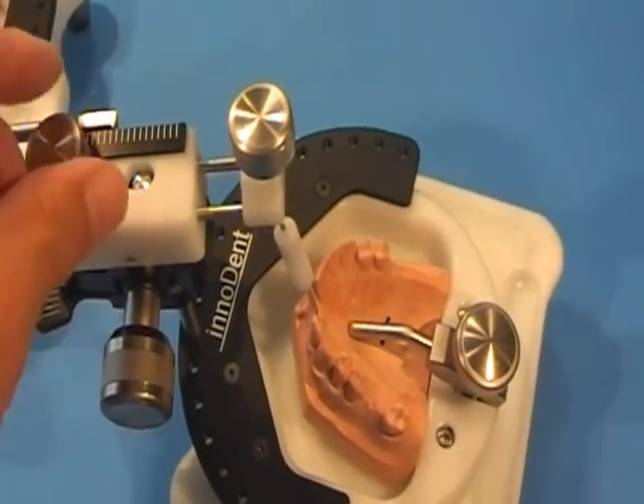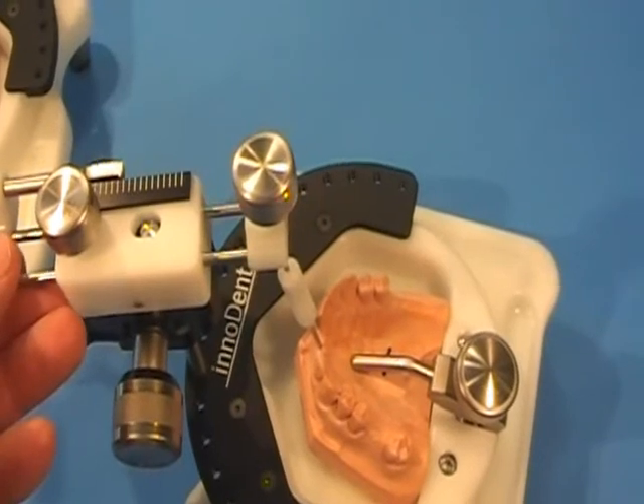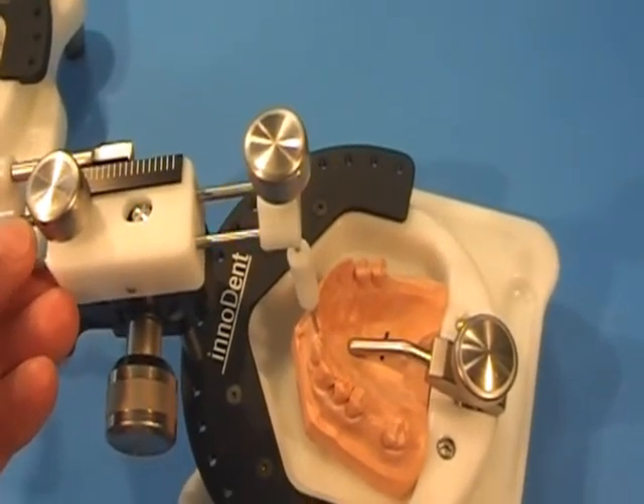With these two adjustments, you can easily adjust the angulation mesial-distally and buccalingually.